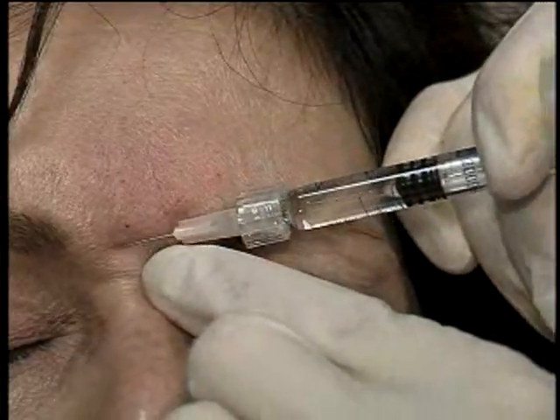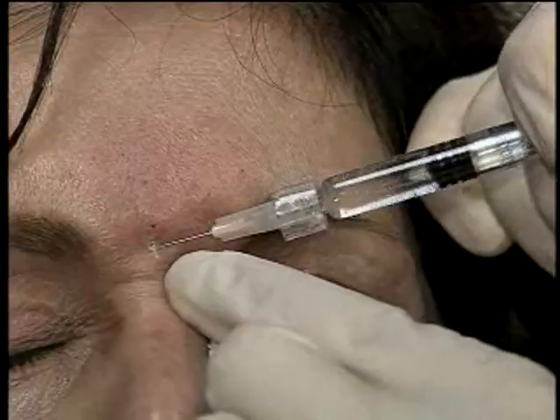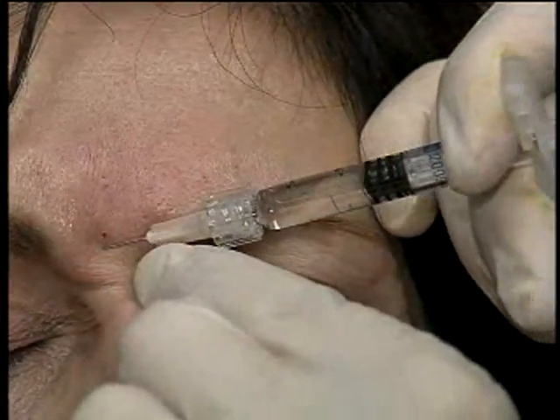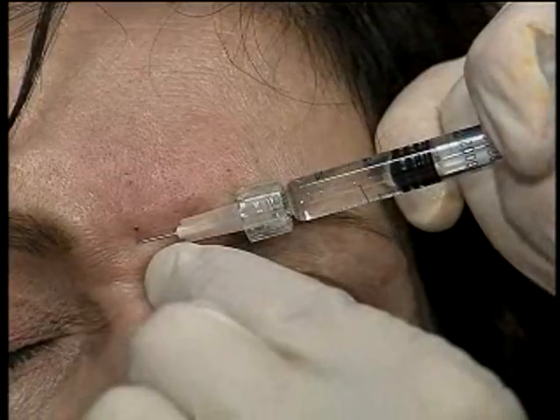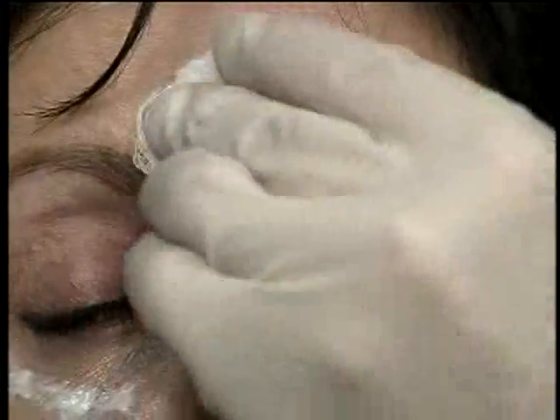And I'm staying in the dermis this whole time. Not much product is required to do this. Maybe 0.2 cc's or so. Okay. And let's see your frown. Okay, good. I think that'll give her a nice result in that area.